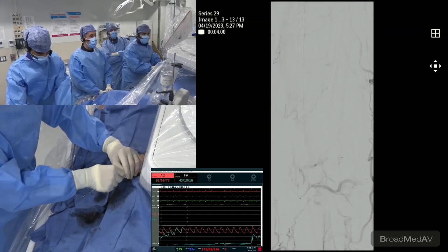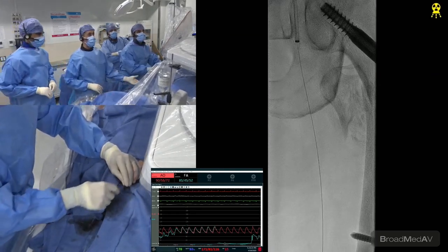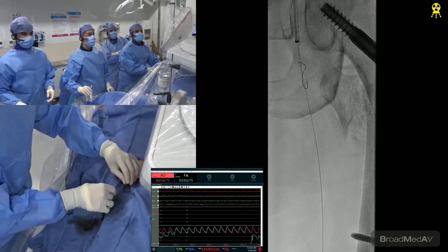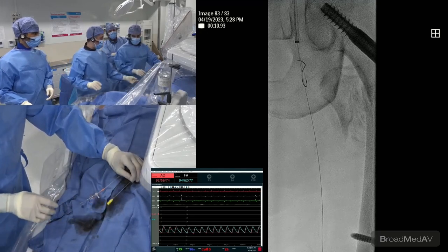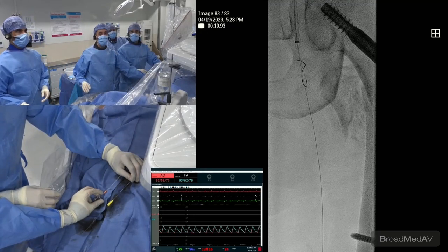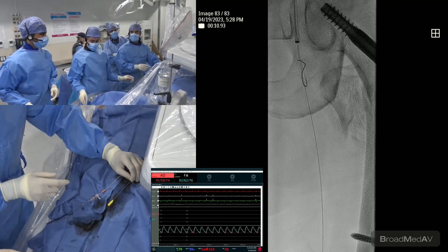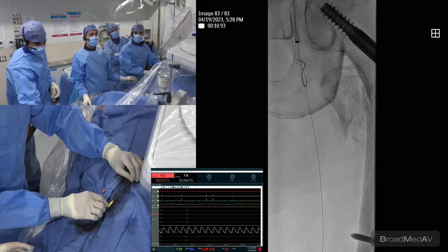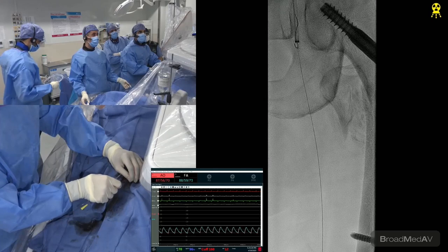So now Roman's going to put the wire distal, and we're just going to zero. We're already zeroed, so that's good. We can just cross it now, Roman. We already are equal to the other pressure. Let's just make sure. Let's zero this guy. Yep, we're zeroed. It's equal. 93. That's fine. Very good. Now cross it. Just let them fully do it. Very good. We're pretty much the same.